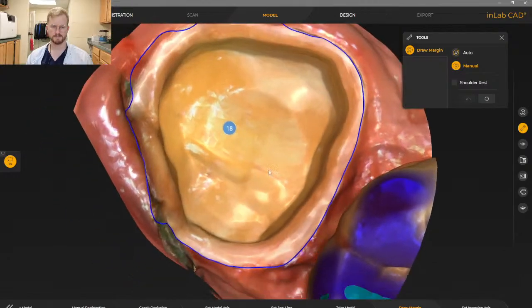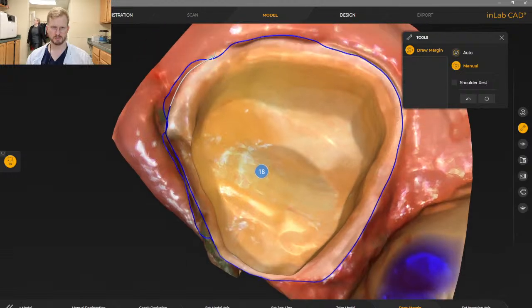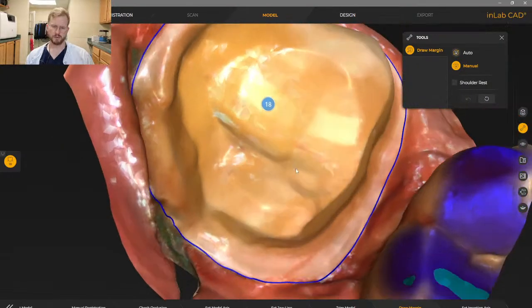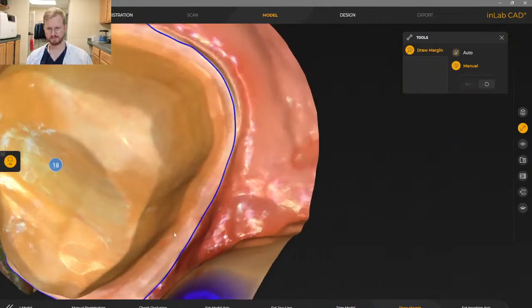It's quite angry. Desperately needs to remove all of that periobacteria. This probably would have been easier to do scaling and root planing first. Let's do 3-5. It would have been better to do. We went ahead and sent it anyway. I was able to get him to quit bleeding to make our nice scan, so he'll be fine.